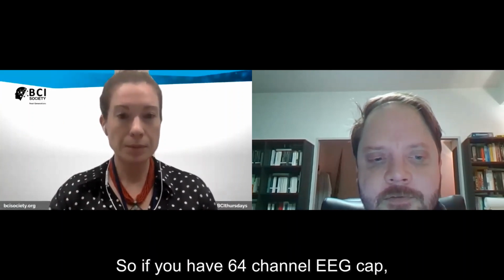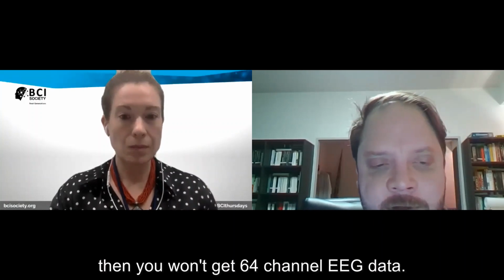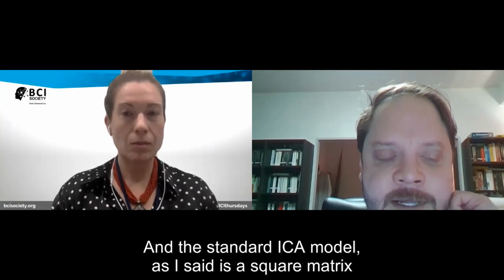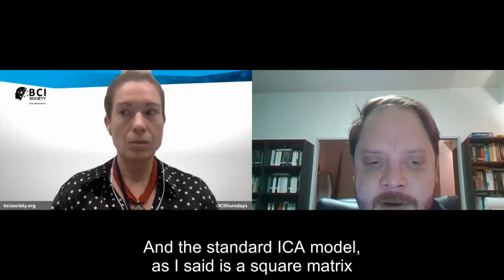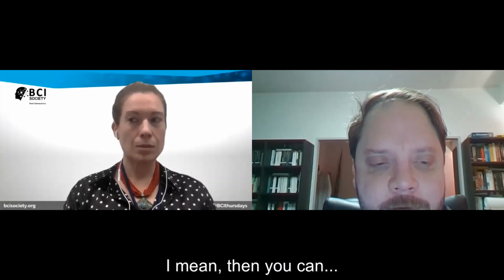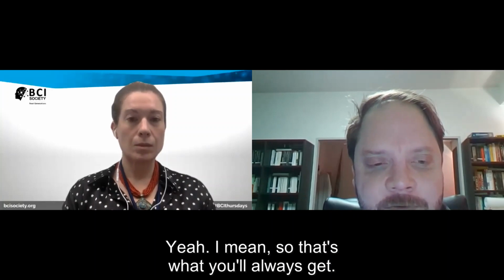So if you have a 64 channel EEG cap, then you'll get 64 channel EEG data, and the standard ICA model, as I said, is a square matrix, which has the same number of ICs as it does channels. So you'll get 64 ICs. That's what you'll always get.